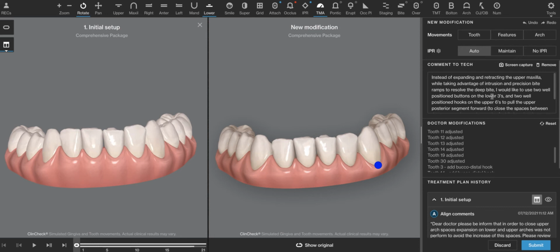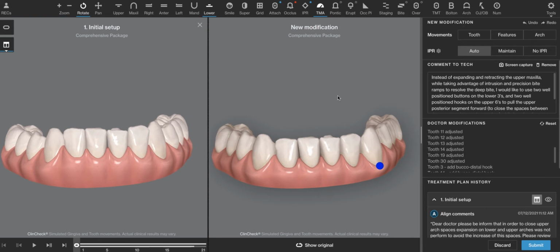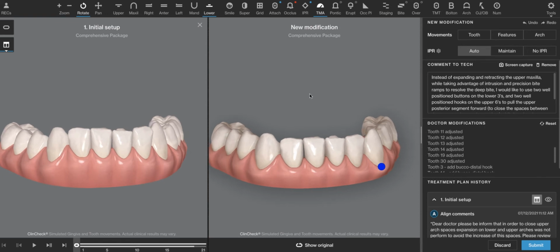Use bullet points. I have found when I wrote in paragraph form that they tend to overlook things. They do one thing and then they go back to it and they skip over things, whereas bullet points seem to be easier for them to follow the directions.